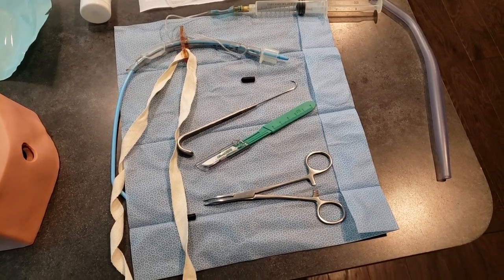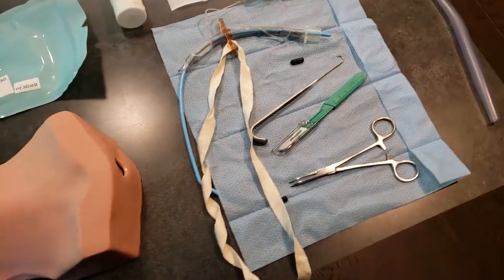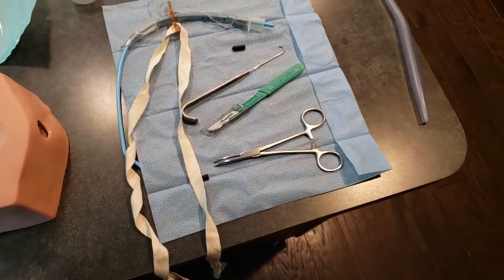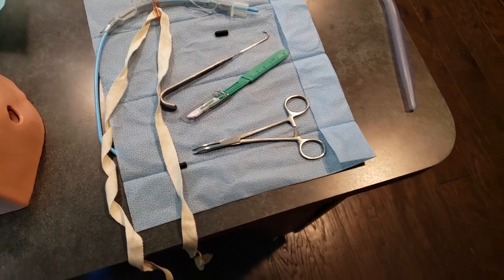Also included is a 35-centimeter bougie, a tracheal hook, and curved kelly forceps for clamping and spreading tissue.